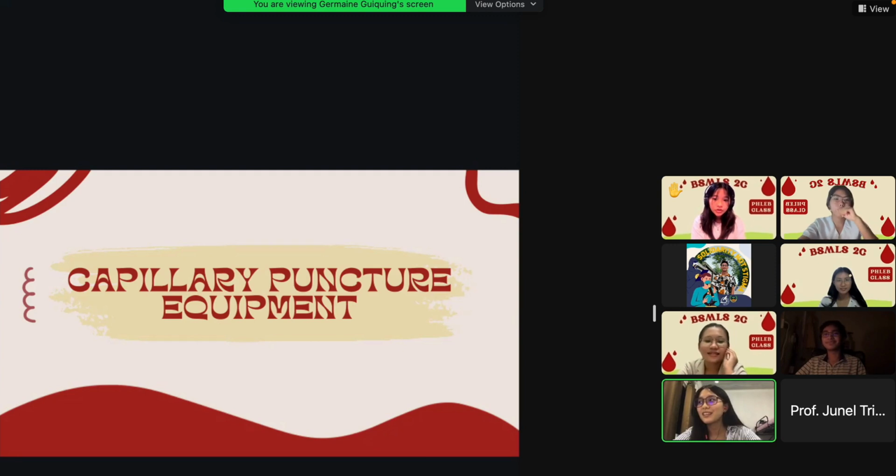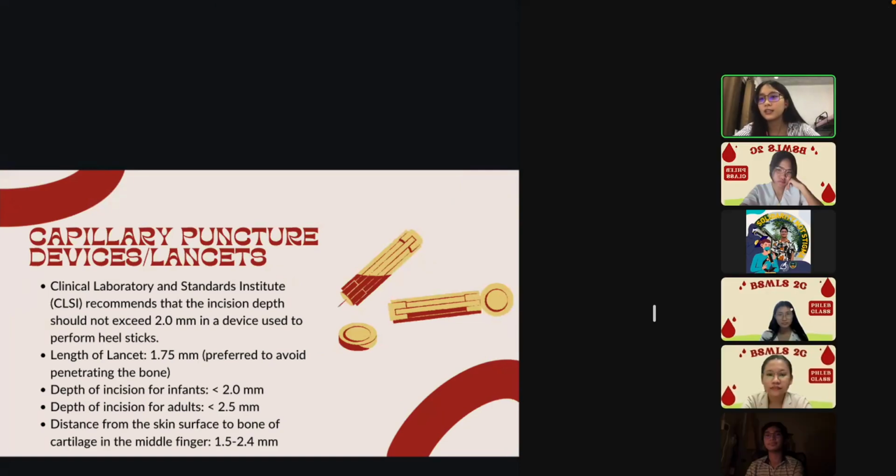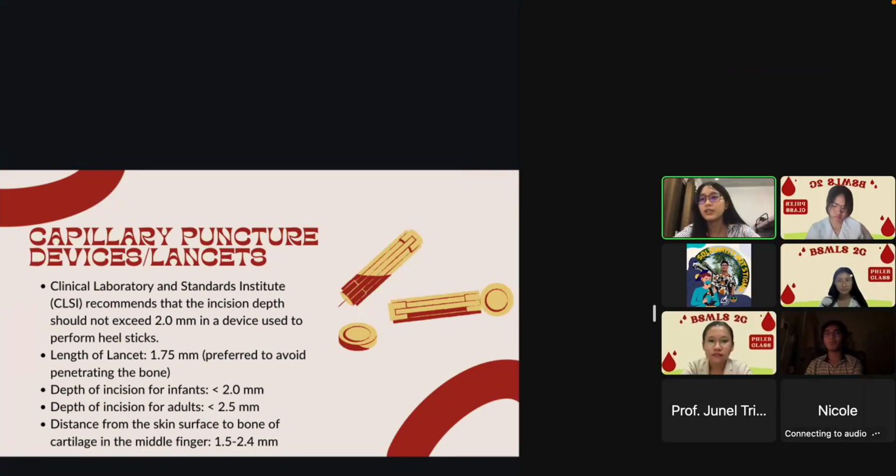Oh, okay, everyone. Good job. So now we will start na with our discussion. So before ko i-start yung discussion natin, kailangan nating malaman na before tayo mag-conduct ng capillary puncture, dapat kumpleto muna lahat ng equipment. So ano nga ba yung mga equipment na dapat nating i-prepare? So first is the capillary puncture devices or what we call the lancets. So ano ang lancets? Ang lancets, these are called your incision devices, which is yung ginagamit mo para i-prick or para mag-cut doon sa heel or sa finger kung saan mo kukuhanan ng capillary blood yung isang patient.